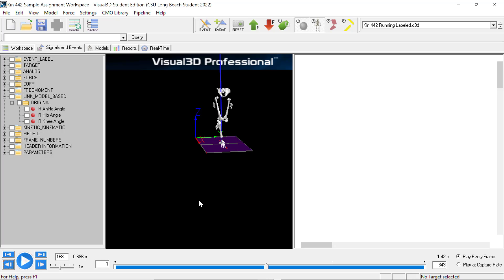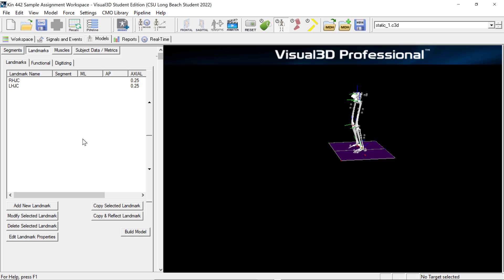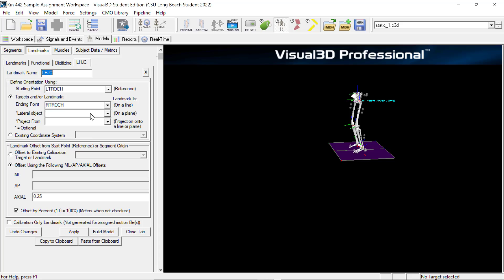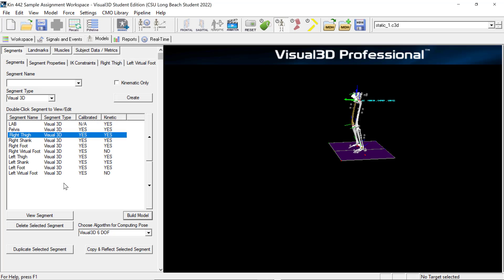Also, when looking at the hip center — which was another error some of you were having — when you go to your landmarks, sometimes the system will not exit you out of the landmarks portion after applying, but it will have created it. So if you just exit out, you'll notice it's already created there. If you keep clicking apply, it keeps recreating the same one. Make sure you first go back and check that it's created, then go back to your segments and continue creating the right thigh. If you have any other questions, please let me know and I'll upload more videos, but make sure you go through all those clusters and verify they're all matching.